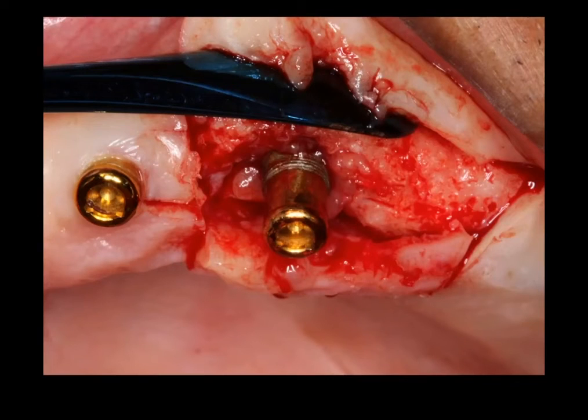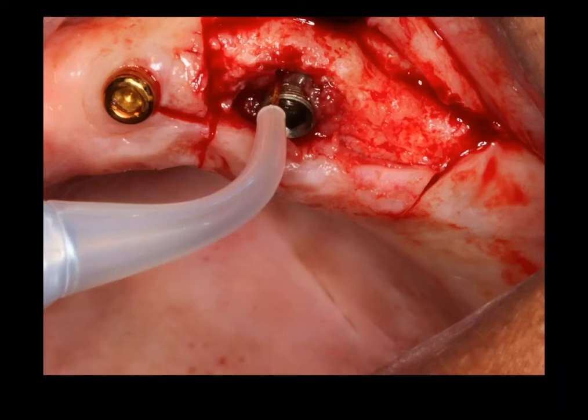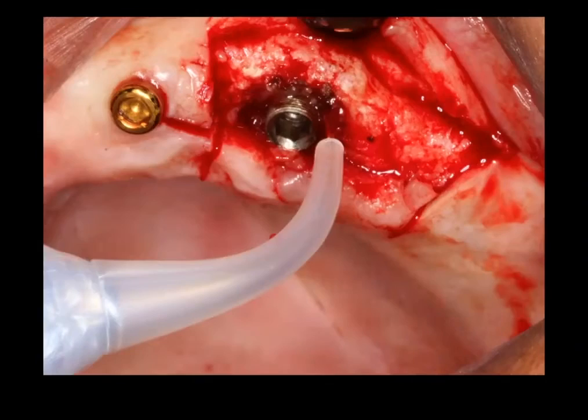So we flap it and you can see the amount of granulation tissue and infected tissue. The implant itself is solid. So we wanted to see the results in this situation to see if we can salvage or save this ailing implant. And so we would curette, try to clean out that granulation tissue to the best of our ability, circumferentially around the area. And then I would use the laser with an initiated tip to try to remove that granulation or to vaporize that granulation around that implant.